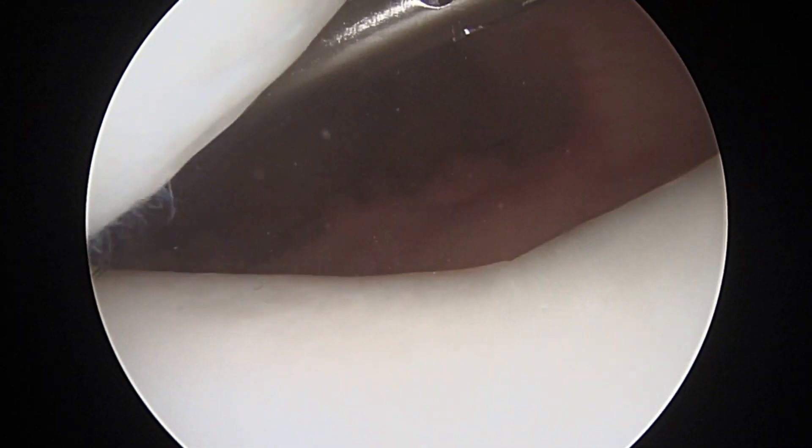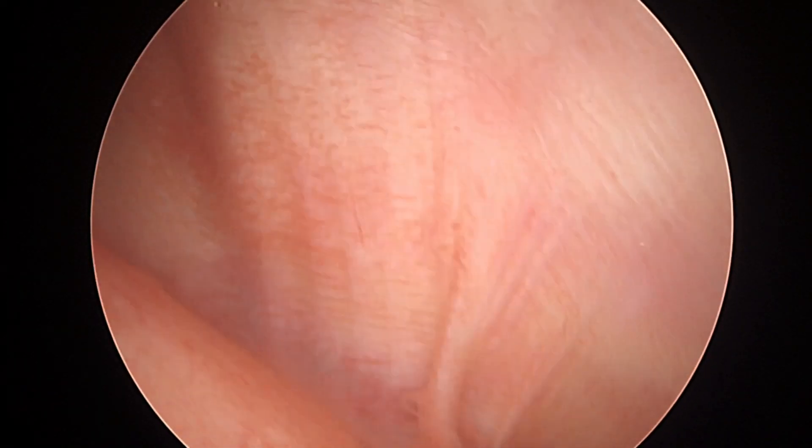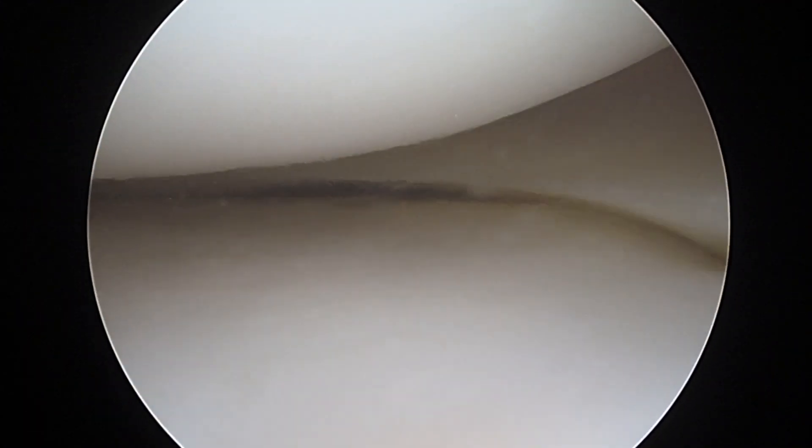Hi, Dawson. Backside kneecap looks nice and smooth. Trochlea looks good. That's the outflow cannula that we've got in the knee to flush fluid through it. So all of that joint looks very good. And let's look at the inside, the medial compartment.